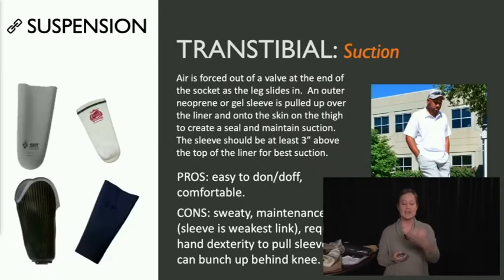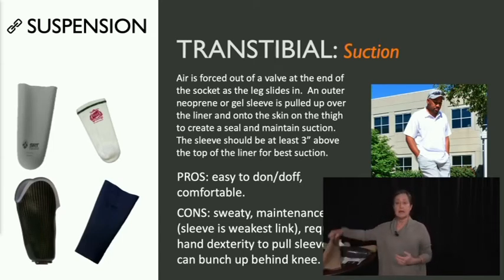Okay, so we're going to start with transtibial. You'll see on the left of your slide, each side has all the pieces and parts that go with this particular suspension system, just to make sure that you're putting it all together. So we'll talk first about suction. At the company where I work, suction is the majority of folks in their first prosthesis for the transtib level.